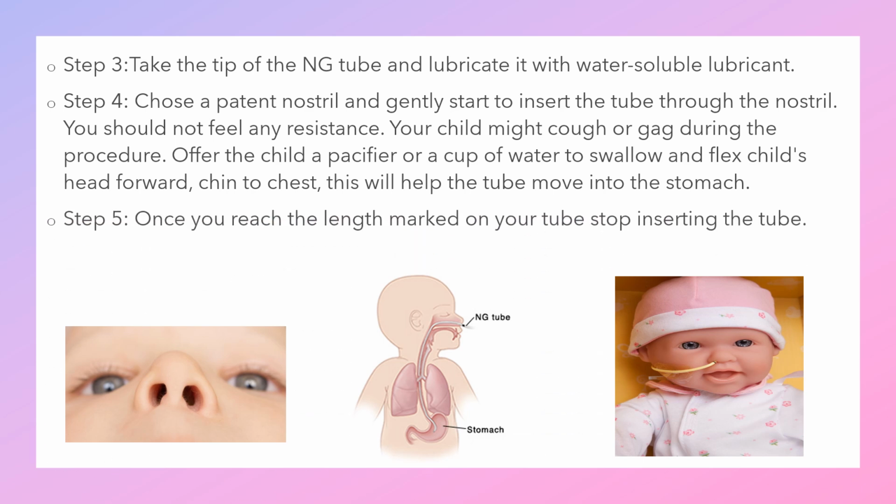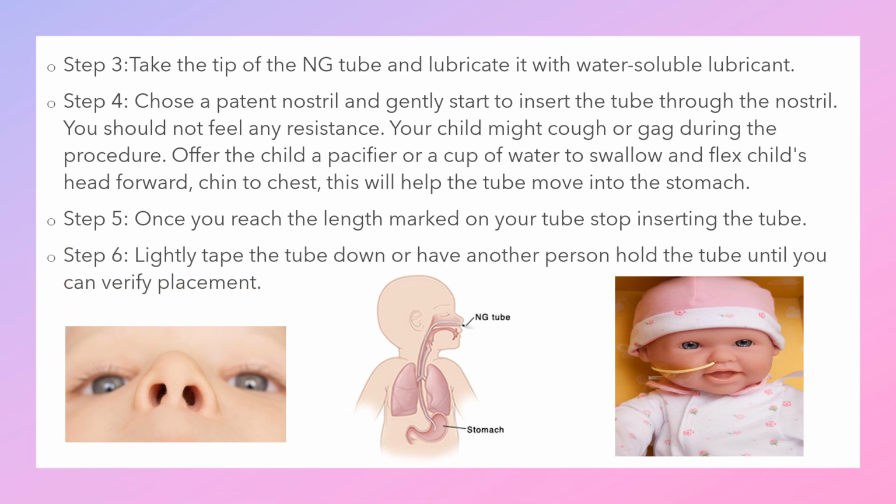Step 5. Once you reach the length marked on your tube, stop inserting the tube. Step 6. Lightly tape the tube down, or you can have another person hold the tube until you can verify placement.